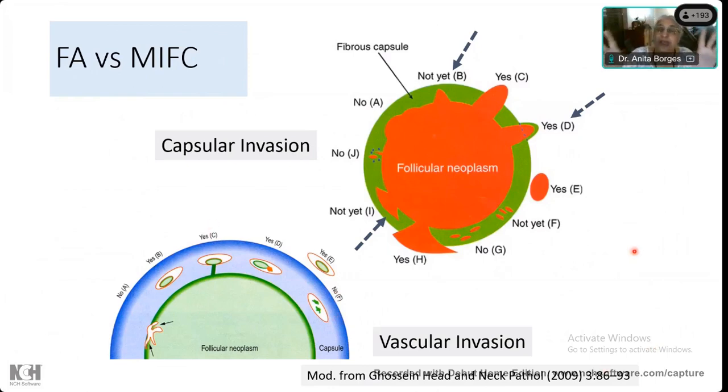Now, can you imagine the confusion that occurs when the tumor is not so nice and round, and its capsule is not so beautifully placed, and it is a large tumor, and you have to take many sections of this tumor, and you may not be able to actually see everything as beautifully as is seen in a diagram. Okay, so it becomes very, very difficult.